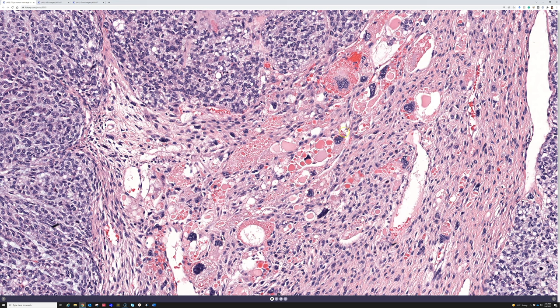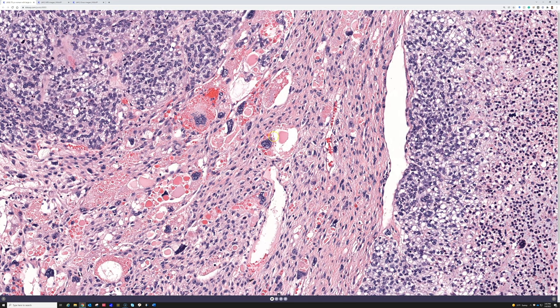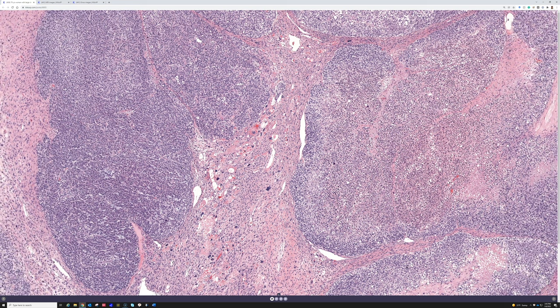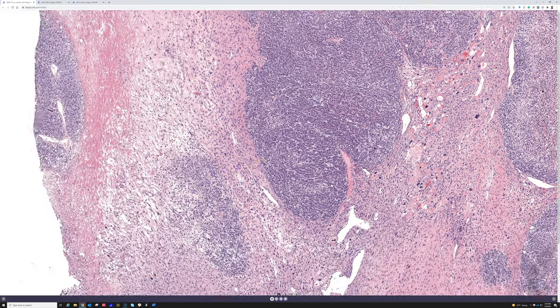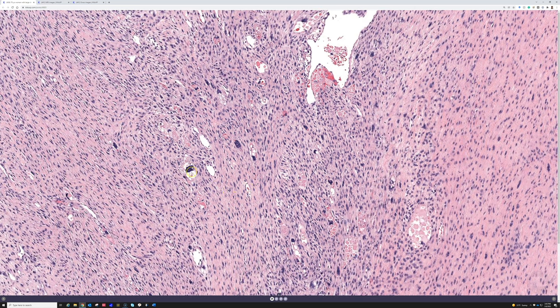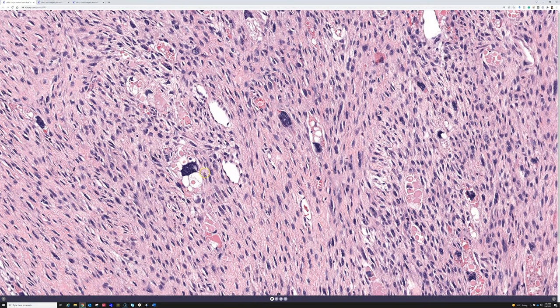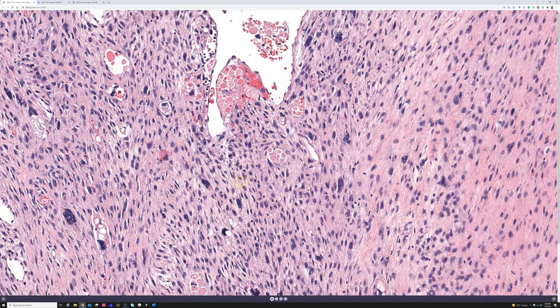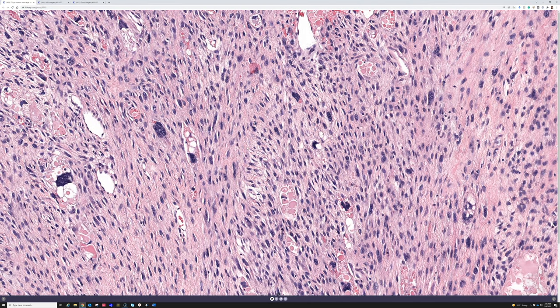Of all sarcomas, pleomorphic liposarcoma has some of the wildest, most atypical nuclei of any tumor in the human body — the most bizarre, massive pleomorphic cells. This case is actually fairly tame by comparison; I've seen other pleomorphic liposarcomas with cells ten times as large. Here's a nice lipoblast with clear vacuoles and proteinaceous droplets, with the vacuoles scalloping and indenting into the nucleus.